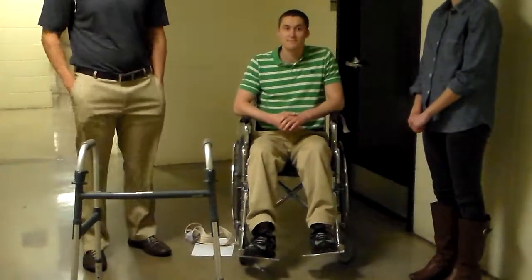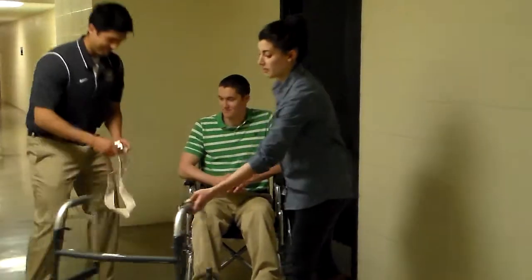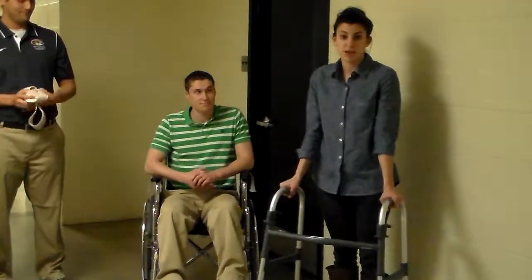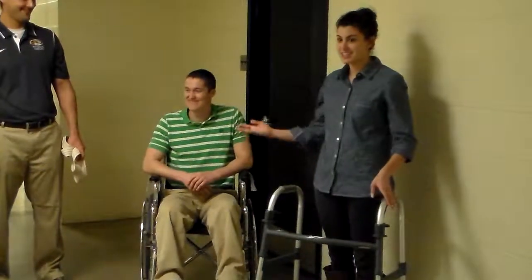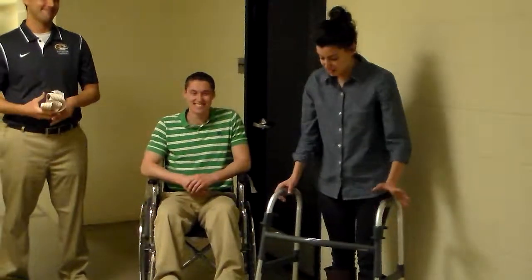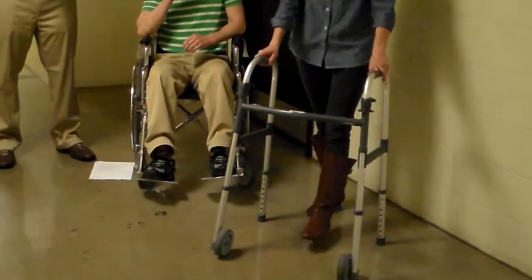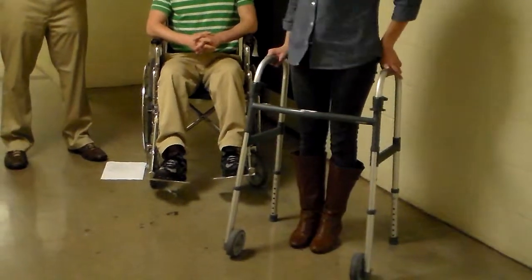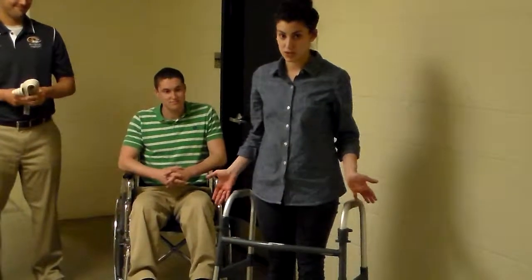So now Lindsay's going to talk about how we're going to get our patient ready. I will demonstrate to Pat the type of gait pattern we're going to use. What we are using is a modified three-point gait pattern, just because she is partial weight bearing on her left side — or he in this case. So we'll go with the walker first. Since the left side is affected, you'll step with the left and then follow with the right. Pat, do you understand? Yes, I do. So every time you teach an ambulation device, always make sure the patient knows and can repeat back what you do.